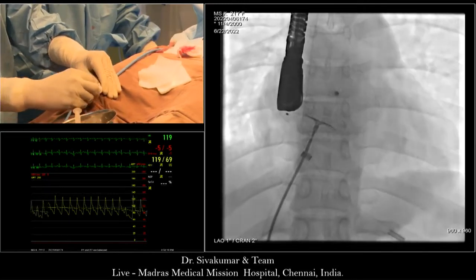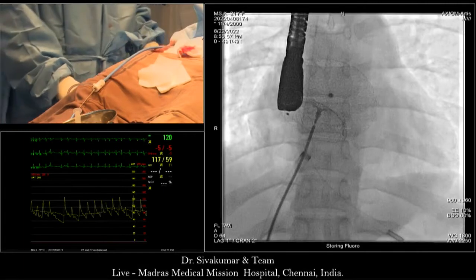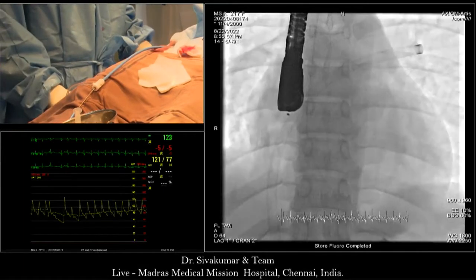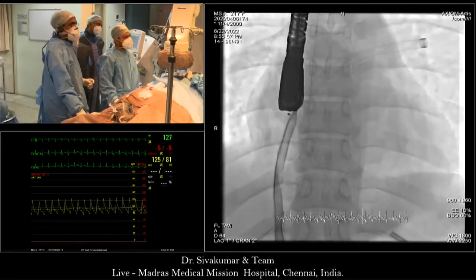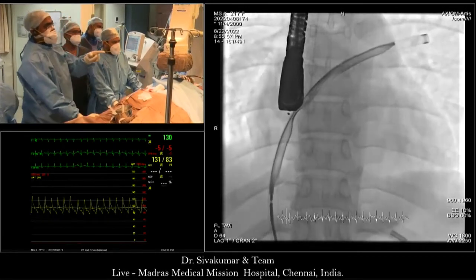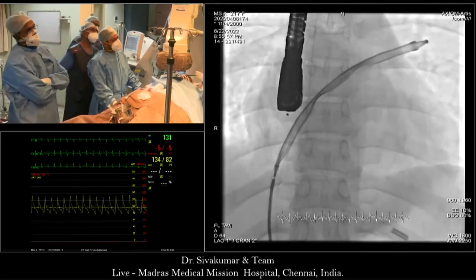So, Srinath's question about fluoro store this. Fluoro store and show it. No. Okay. Siva, again recheck the positions. I missed the deployment in there. I'm showing you, Iqbal, I'm showing you now. Wonderful. I'm sure it looks beautiful. Let's have a look.